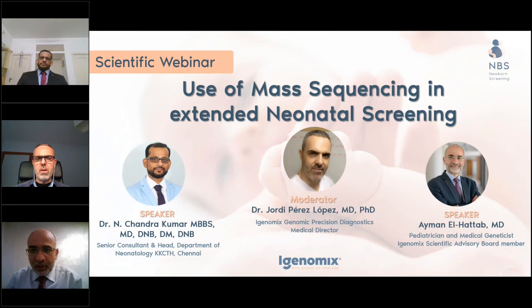So I think at this point, the panels are what many people started using. However, with more experience, because we just started with the utility of NGS and newborn screening, I think we need to learn from our experience. So gene panel at this stage is I think the most appropriate, but in the future, most likely the panels will expand, and at one point, people will consider exome and genome, but to start with, gene panels.